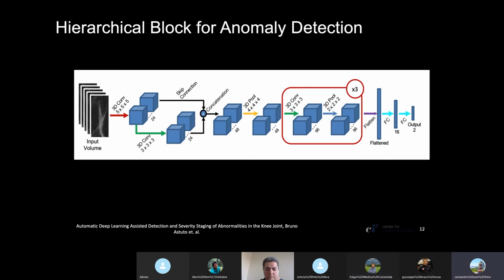Why didn't you try more skip connections? Why I didn't try more skip connections? I did. They don't help. They increase the size of the model, and I had to fight overfitting a lot to train these models. I did a lot of data augmentation and used a lot of regularization.